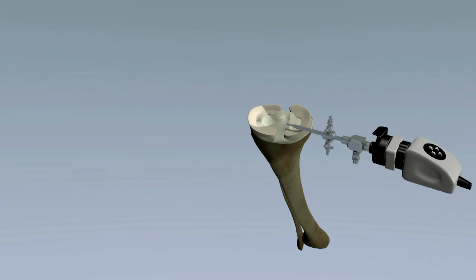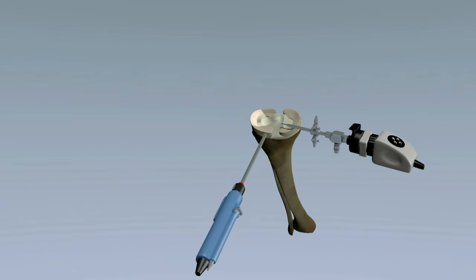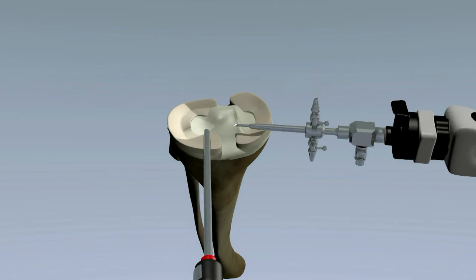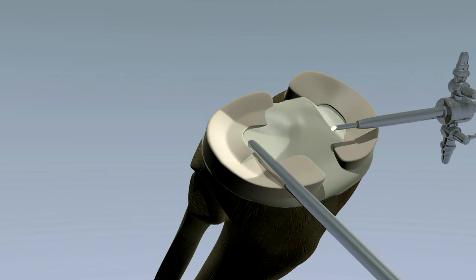When a meniscus tear is not repairable, the torn portion of the meniscus is shaved away. This results in a smoother edge that does not catch or cause pain.